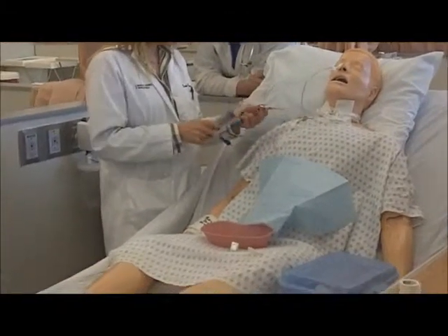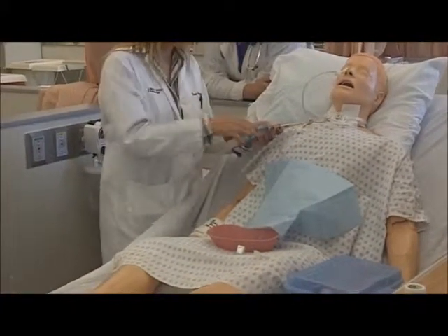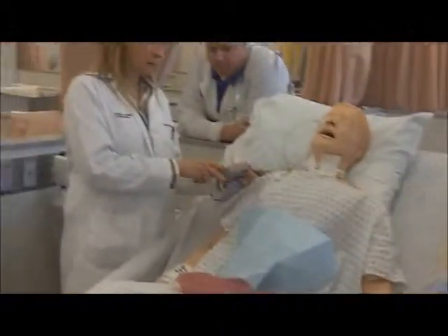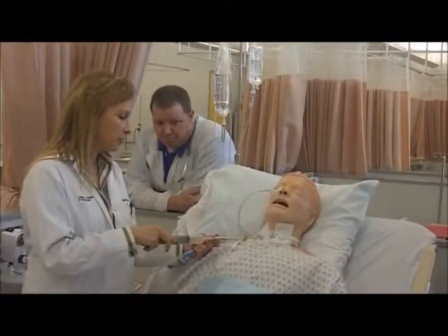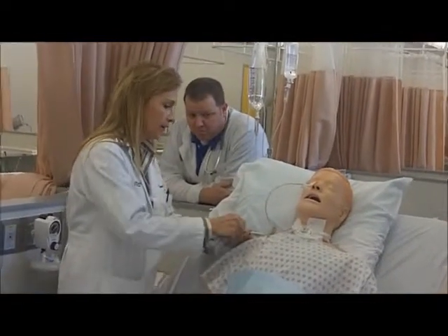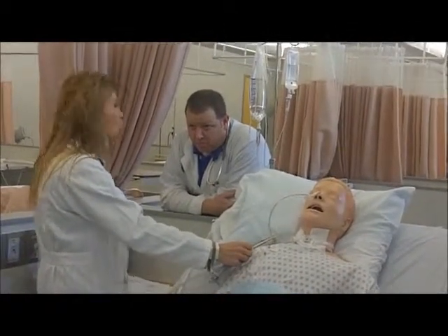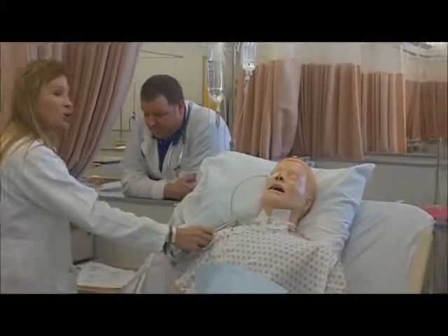I take this off, I place this, I put my stethoscope on. Yes, it's placed. Okay, I want to irrigate it. Pull up normal saline. How much? 30, 40, and I just go here. And then I turn here, and I pop this to high. I want to empty out whatever's stuck in there. And you hear, oh yeah, there it is. Yeah, I knew it was in there. So, it's just common sense.